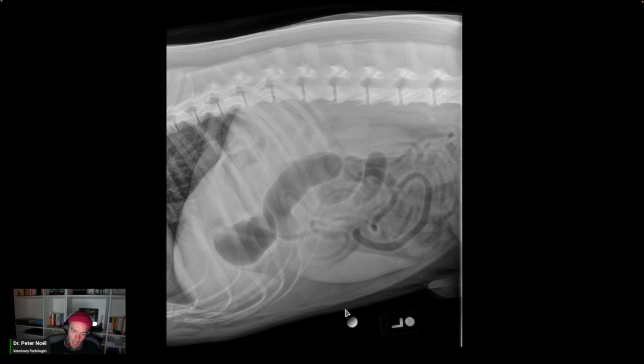So the liver is kind of skimpy in this particular dog, and so you wouldn't be wrong to say, hey, this could be, the wording on this would be, unfortunately, a normal variant. I have noticed anecdotally that pit bulls tend to have smaller livers in health, but you could raise a flag like maybe this liver is kind of skimpy. And the differential diagnosis for that in this particular dog could be a normal variant, depending on the breed. I forget the breed, but it could be a breed-related variant.